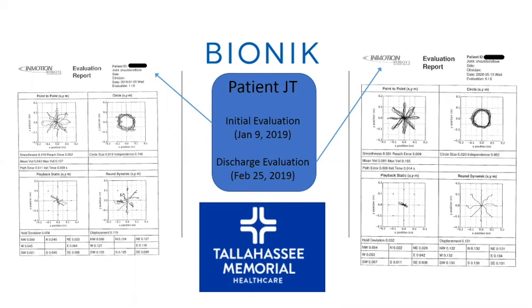The other thing that you can do is the device does have a USB port in the back of it. And so you can just download to a USB drive and then download that into your own EMR, so your own medical record system. Now, again, the caveat to this one is always check with your IT department before you download anything onto a USB, and then also get permission to interface with the EMR within your facility. Okay, good addition there. We don't want to get anyone in trouble.